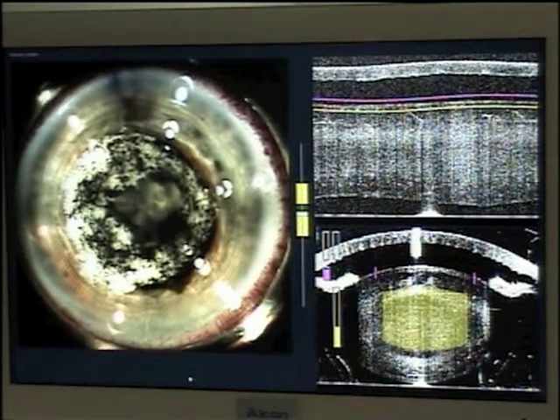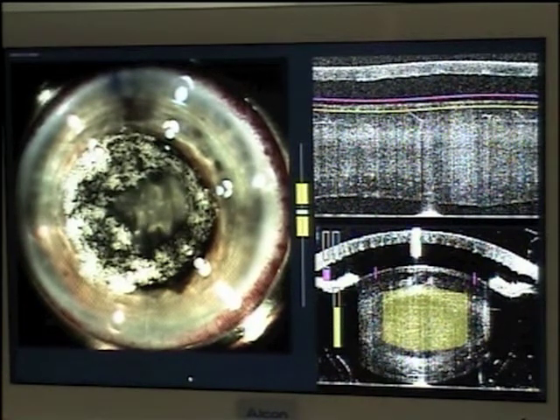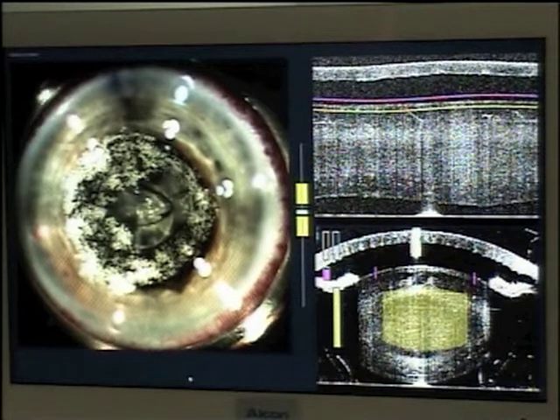And now we're performing the lens fragmentation. 3 intersecting lines will separate the cataract in 6 symmetrical pieces, and then a circle at around 3 millimeter diameter will further dissect the lens in a cylindrical fashion from the center. You can see the breakthrough bubble here coming out from the cataract just under the anterior capsule. And then we'll see our main incision after this part is completed.